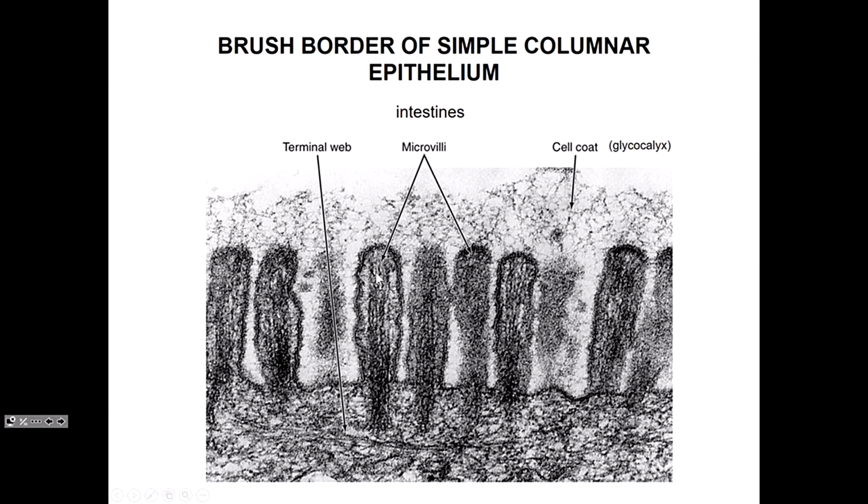Also, cilia are going to be quite long because they're quite often motile, helping to move things along in a duct or some structure, right? These aren't long enough to be doing that sort of thing. Also, you see this thick glycocalyx, so that's going to kind of glue everything together, right? So what's the point of this being motile if all of it's covered with goop and it's stuck together? You want single cilia if you're going to be pushing things along. If you've got goop all over it, it can't be pushing things along.